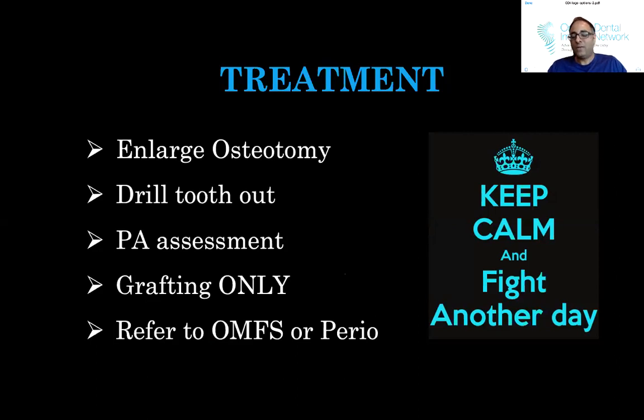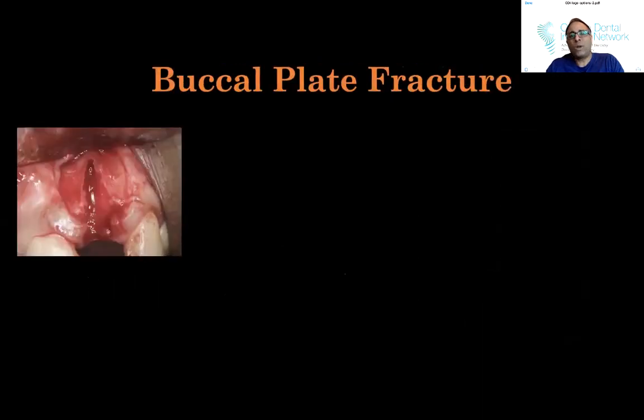I mean, if you feel like you can't do it... But again, a careful assessment of the tooth before is really important. Now, what else can happen during the implant surgery? And again, the extraction cases would apply for those who are doing immediates, like an immediate anterior or a molar. Also locator cases, if you're extracting the teeth, and of course, all-on cases as well.